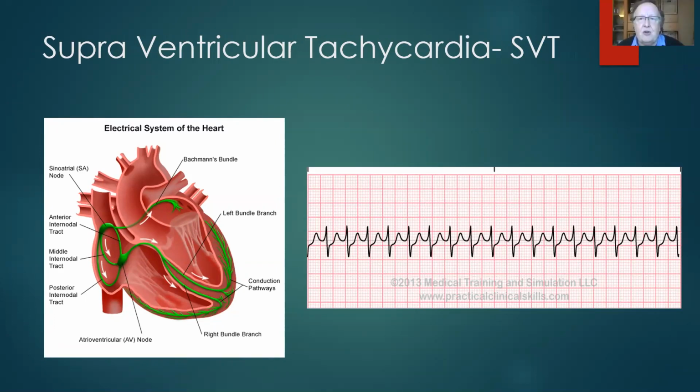Okay, now supraventricular tachycardia. This can happen in young people. And here's a quick cautionary tale for us. I remember many, many years ago, we had a situation where we went to a call. A 23-year-old lad was stood outside a post box. He said, I've got chest pains. I went, really? Back of the ambulance, sit on the left. Oh, I suffer from SVT.